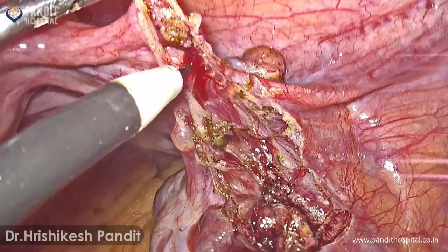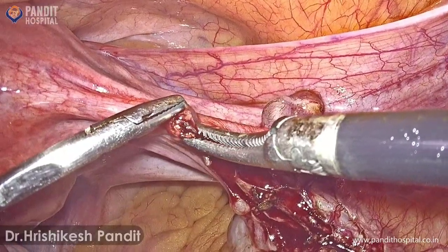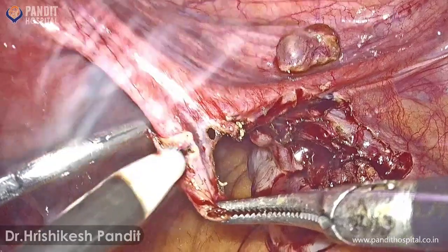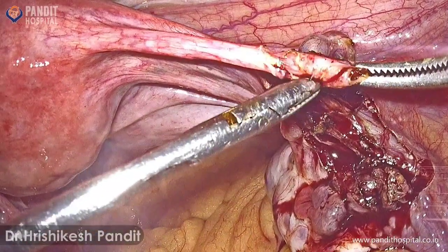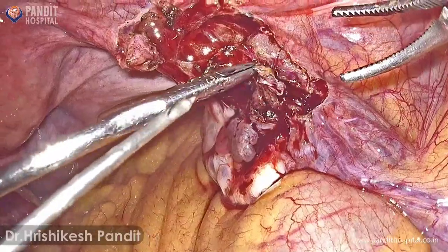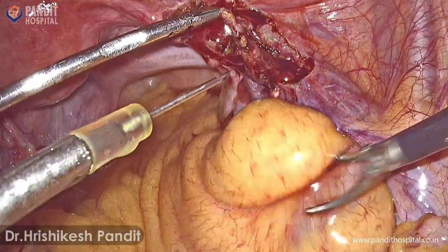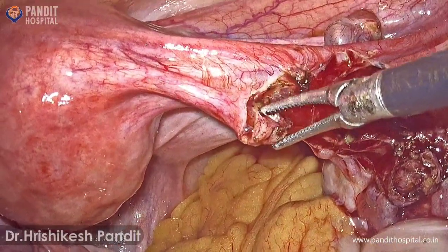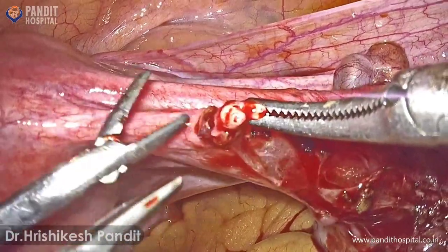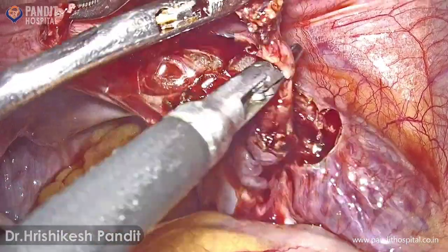I am getting only 2 to 3 mm length on the distal portion of the tube. On the proximal segment, I am cutting the serosa, then gripping the muscular layer. For opening the mucosal layer, I am going to use cold scissors. Before cutting, I am going to inject vasopressin so that when I cut the mucosal layer it should not bleed much. The main purpose of injecting vasopressin is to visualize the lumen of the tube properly without bleeding.